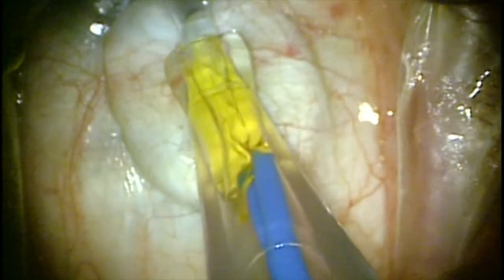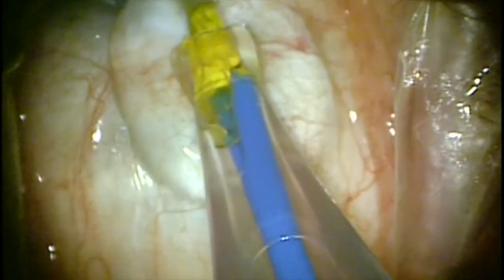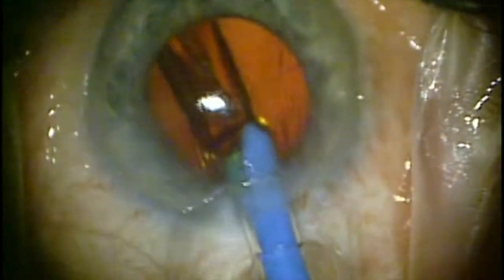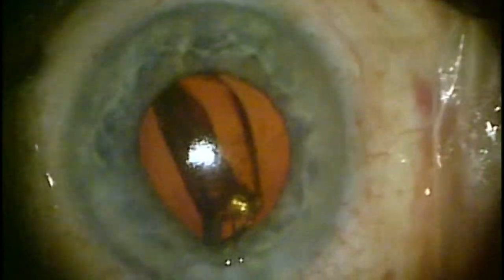If you do find yourself in the situation where the leading haptic is straight, Alcon recommends that you rotate the device clockwise, advance the lens until the haptic is completely outside of the cartridge. Once the tip of the optic starts to come out of the cartridge, rotate the device counterclockwise to exactly its initial starting position and then advance the lens until it's inside of the eye.